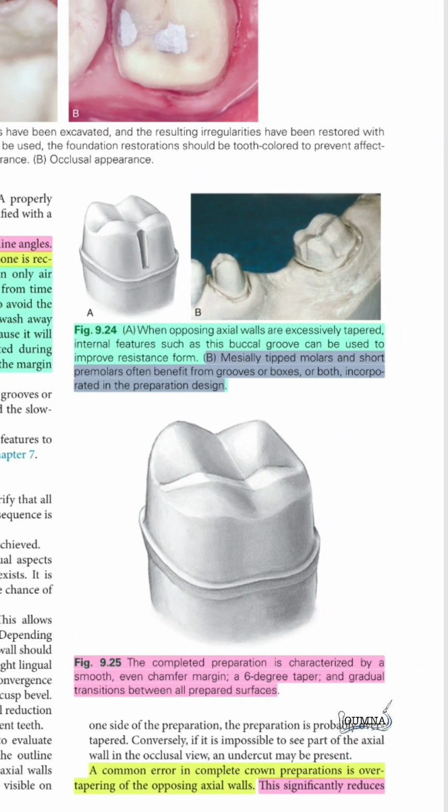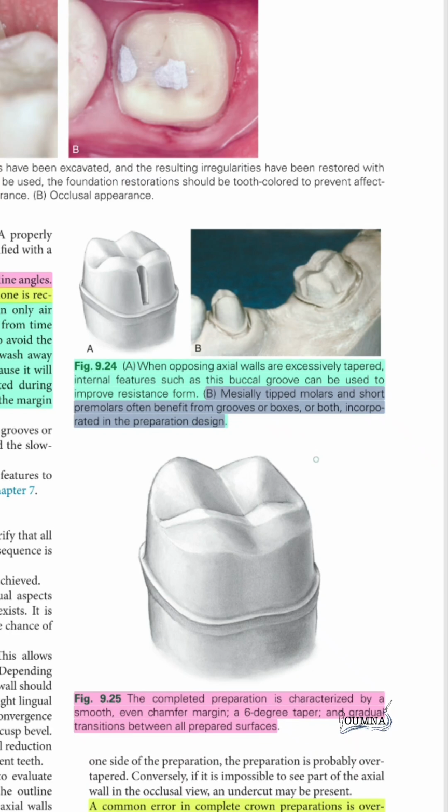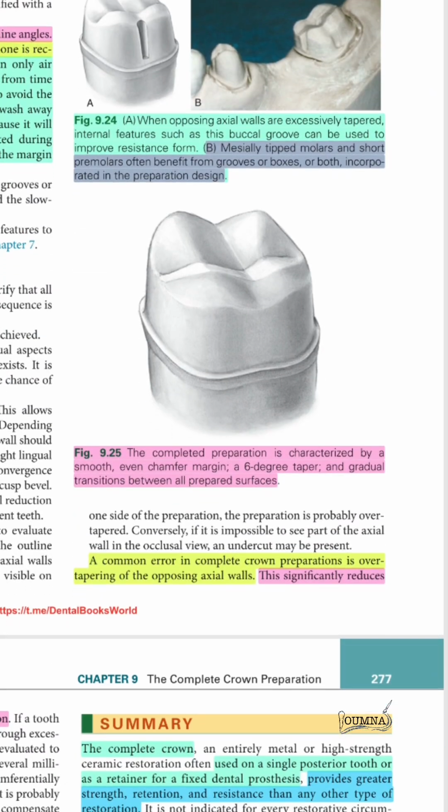When we have a mesially tilted molar or teeth, and we have a short premolar, it is beneficial to use grooves or boxes during the preparation, where we improve the resistance form. It is noted that this applies to a metal restoration and not to ceramics.